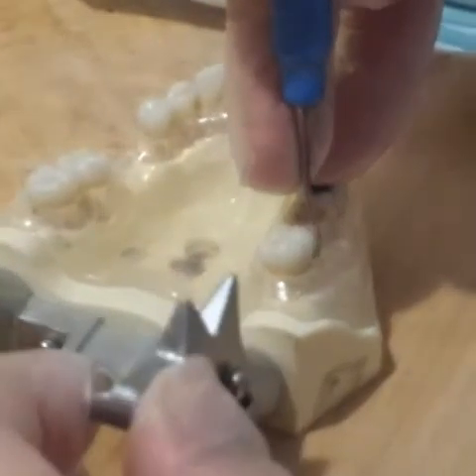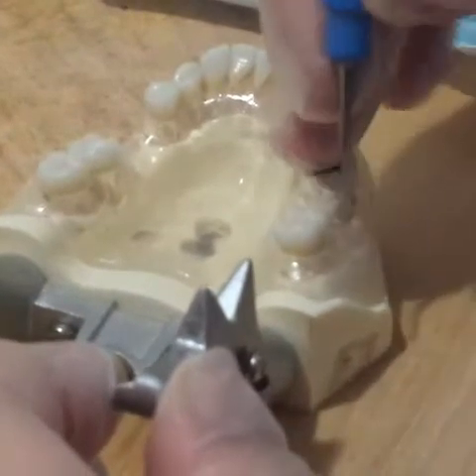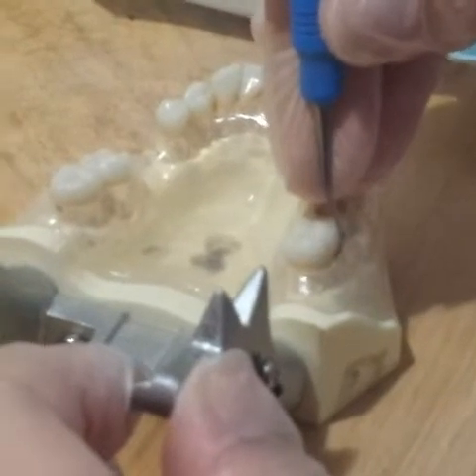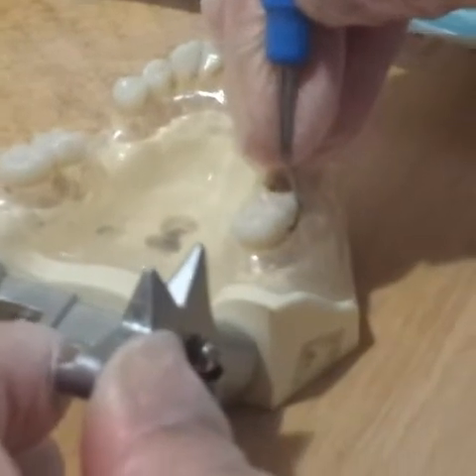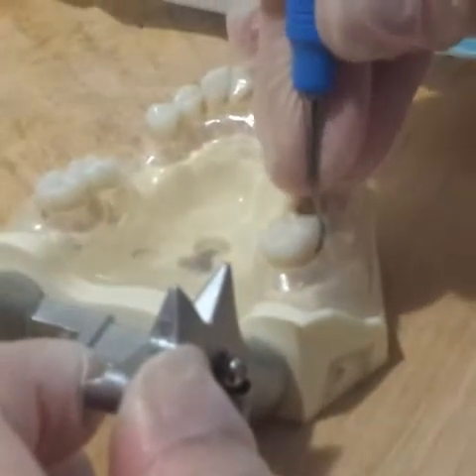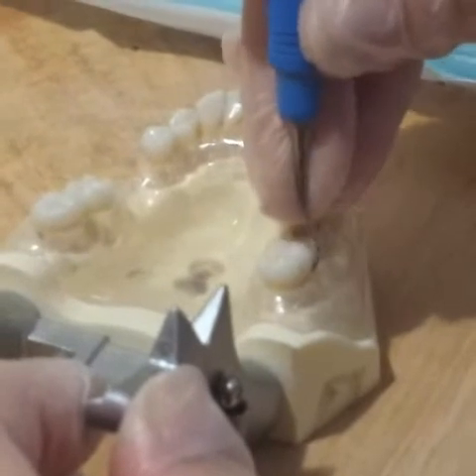If you do locate any calculus, move the instrument under the deposit and apply pressure to your fulcrum finger while placing lateral pressure to the surface of the tooth. Begin instrumenting. Move the instrument firmly, making the necessary strokes to remove the deposit. Wipe the instrument with gauze and continue to the next tooth.